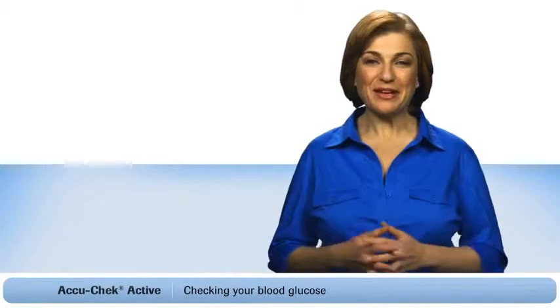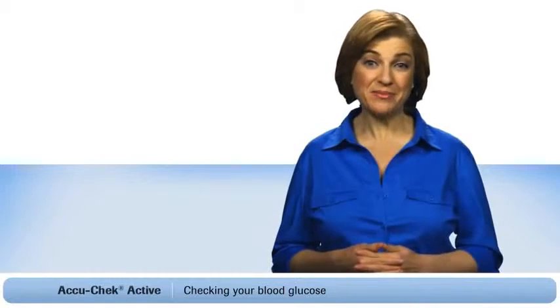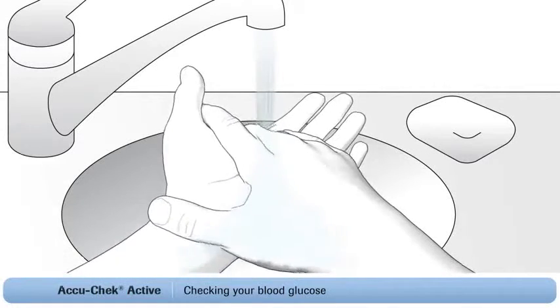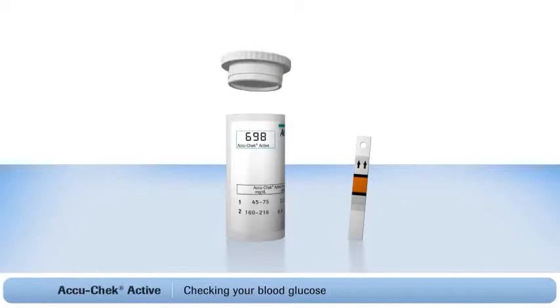Now you're ready to check your blood glucose. First, you'll need to choose a finger to take a sample from. It's best to alternate between fingers as they can become sensitive over time. Remember to always wash your hands with warm soapy water and dry them thoroughly before you check your blood glucose. Take a test strip from the container and always remember to immediately close the lid tightly. This helps protect the remaining strips.